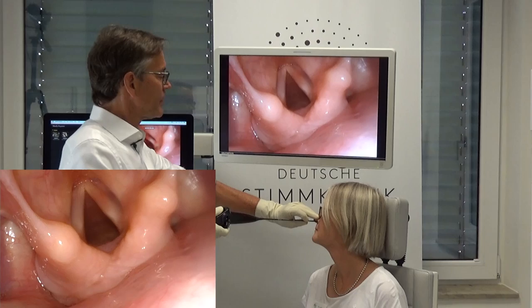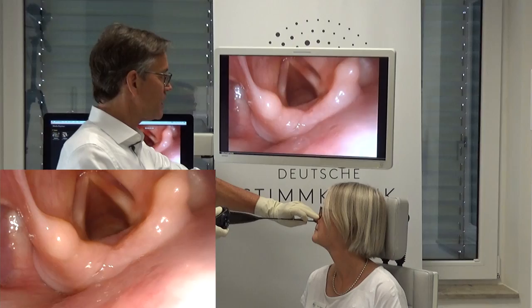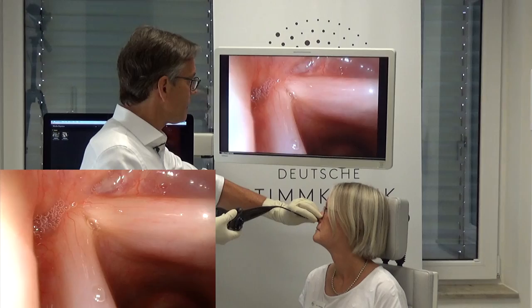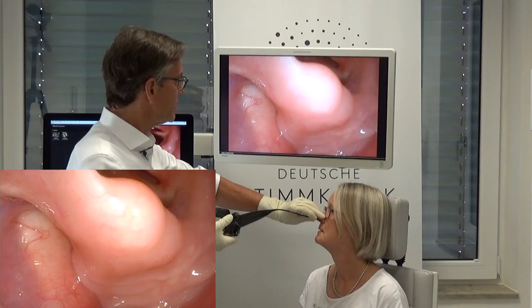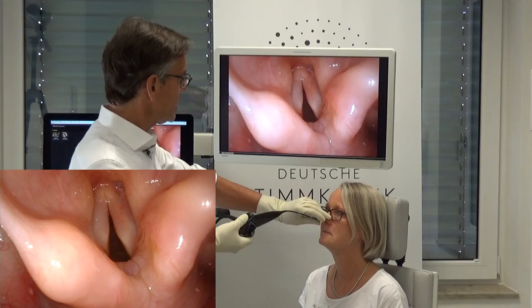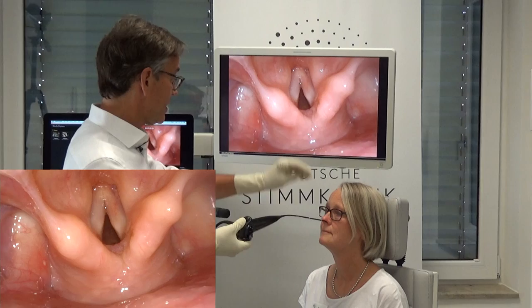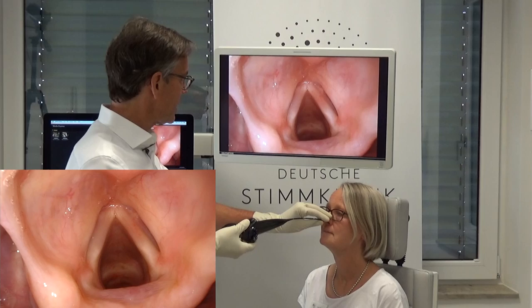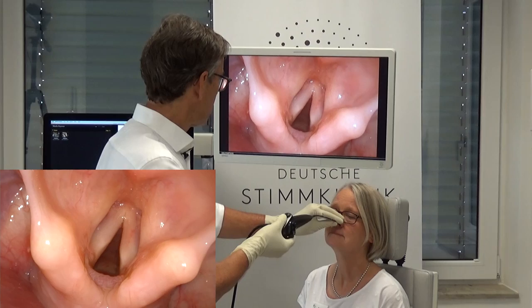Let's go all the way to the right side — I can expose even more. Now I'll combine this with the dipping maneuver. First I ask her to swallow because my image is a little blurred, and now I ask her to give me a long inspiration. Did you see the right vocal fold? Now, when I'm in the straight position the endoscope seems very straight. The right vocal fold looks different because the endoscope is on the back of the vertebra, and as you can see when I advance it a little bit more, it will sometimes flip over to the other side.